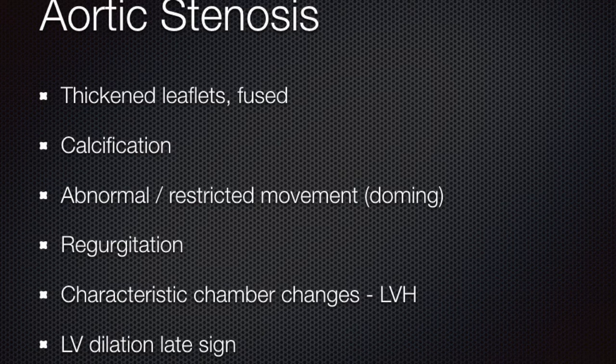So there's an increased pressure trying to push the blood out, and sometimes as well, when you have bad regurgitation, it can cause dilation of the left ventricle. So remember we said the internal diameter at its most relaxed, which is the end of diastole of the left ventricle, should be no more than 6 centimetres. So often, for most people, it would be an absolute maximum of just 5.5, but it's easy to just remember 6.